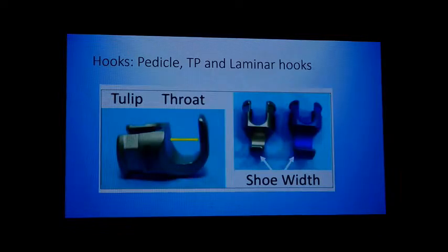So that's about pedicle screws. So now we come to hooks. It's not generally very widely used, and my experience is also limited. I have a disclaimer: I have not used laminar hooks, but I have used pedicle hooks and TP hooks.